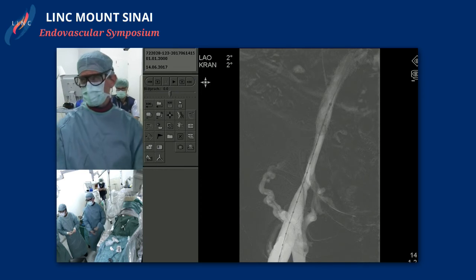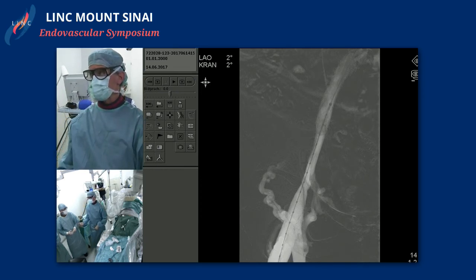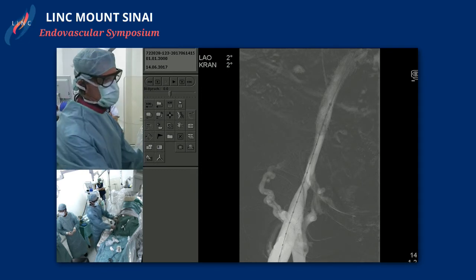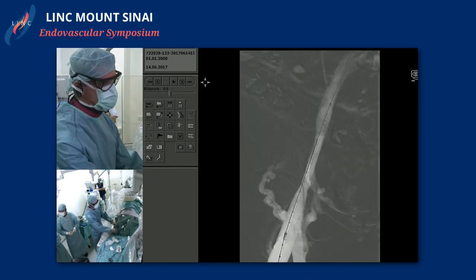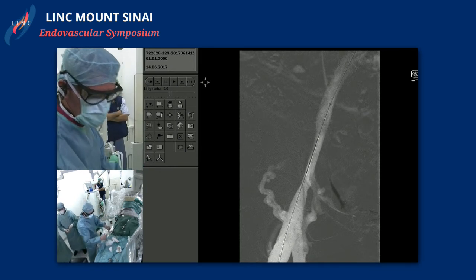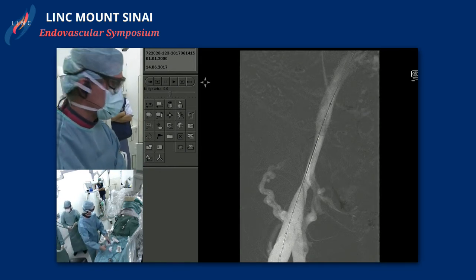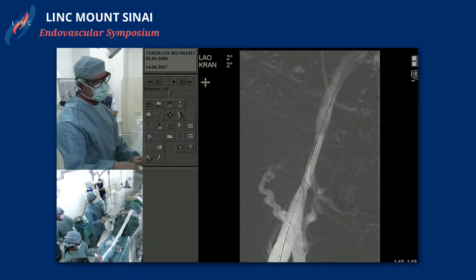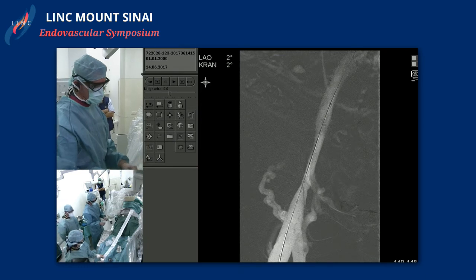It will only be completely different in design. It will be open cell. You will see it looks very flexible. These are, so to say, stent segments which are connected to each other only by 2 bridges always. So that makes the stent relatively flexible, and therefore maybe a good design here for the ligament area.